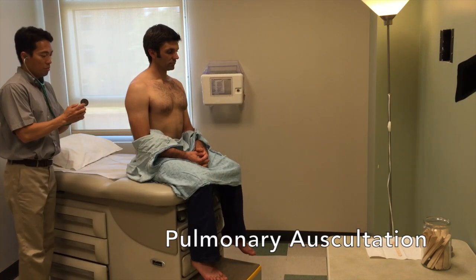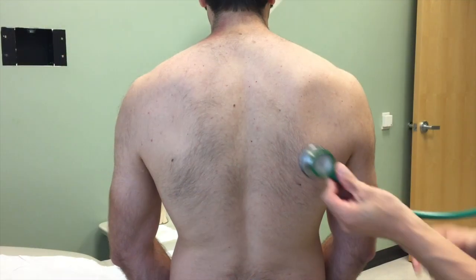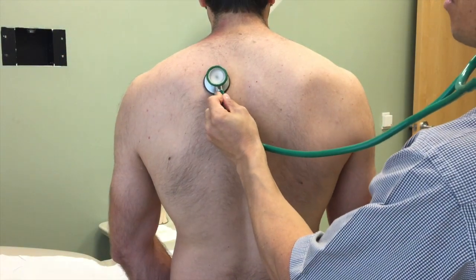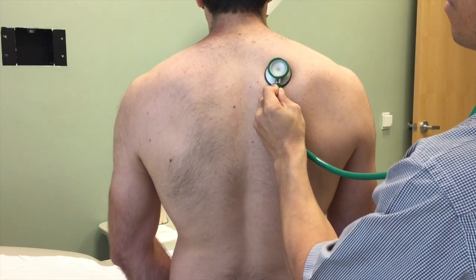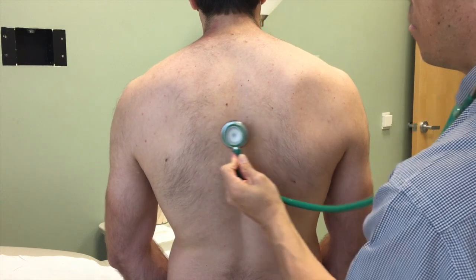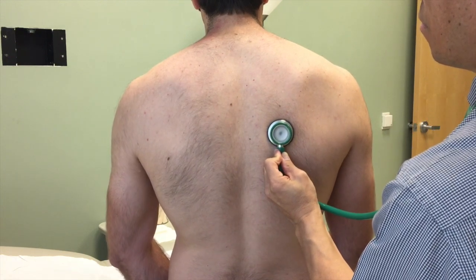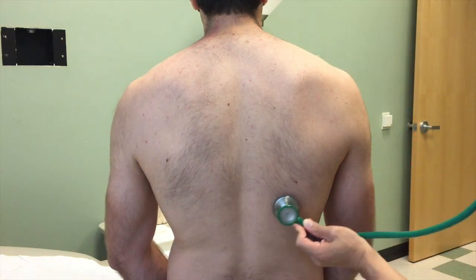Next, for pulmonary auscultation, you want to switch back to the diaphragm of the stethoscope. Instruct the patient to take a deep breath through their mouth on your command or each time they feel the stethoscope placed on their chest. Listen to each position through one full inspiration and expiration. As you can see, I'm auscultating on symmetric areas of the chest before moving to the next position.